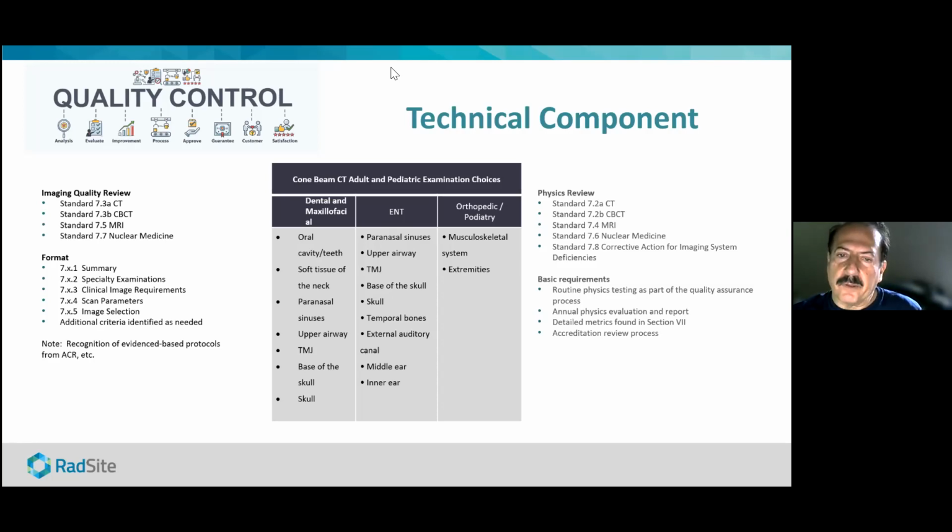Would a peer who has expertise in CT interpretation of these areas feel as though the examination was performed properly? Would that expert believe that the study was of a sufficient quality and that the dose used was the reasonable dose for the patient, given the indication for the study, and that the report is a reasonable quality report?